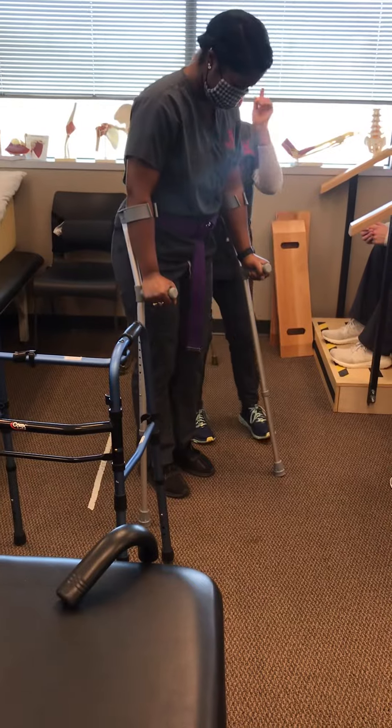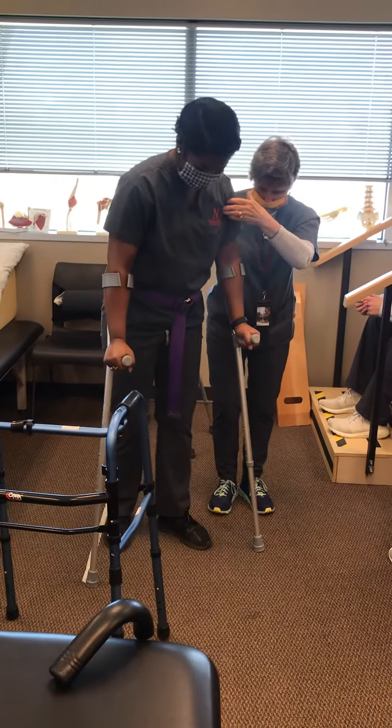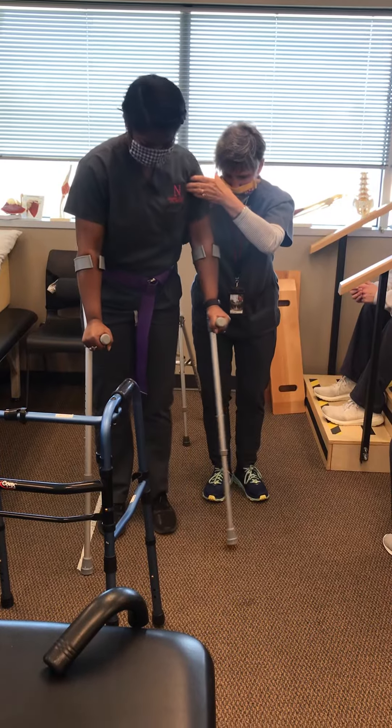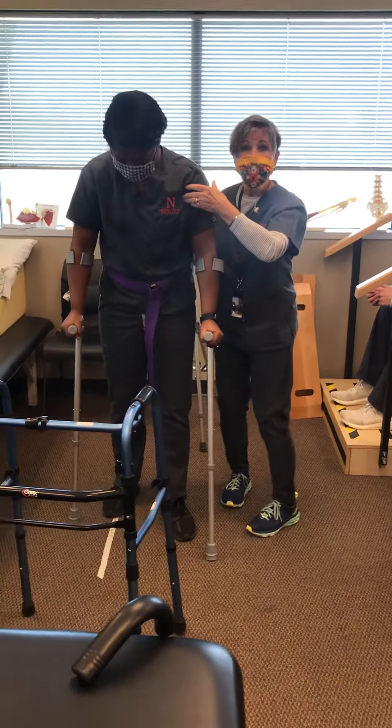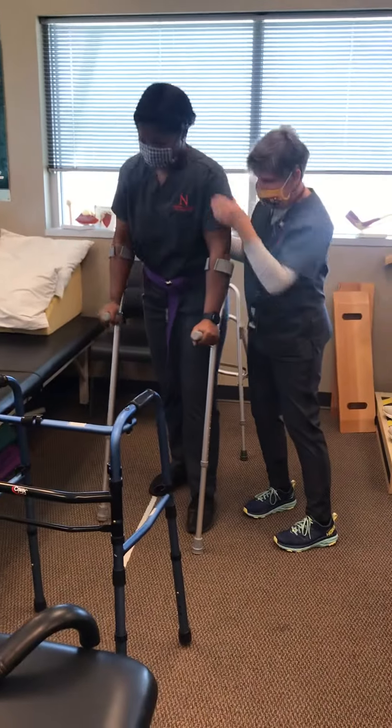Let's turn around. We have them turned to the strong side. Again, to avoid any possibility of weight there with the pivot. That leg is following along — it's not leading the way.